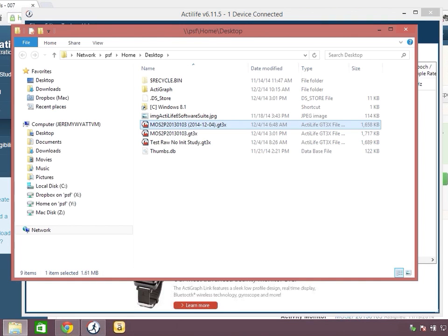I had a question about validation for the Link device from Sophia. Sophia, we are just as anxious to see some validation and comparative analysis between the devices for any of our devices. We're just as anxious as you are. In fact, we're awaiting the release of the NHANES data set, as well as the algorithms that have been developed against that data set, so that we can then provide that to you, the customer, in an easy-to-consume format. But today, those are few and far between. Very hard to find validation, especially for physical activity. I'm sorry, for calorie type or MET type energy expenditure.